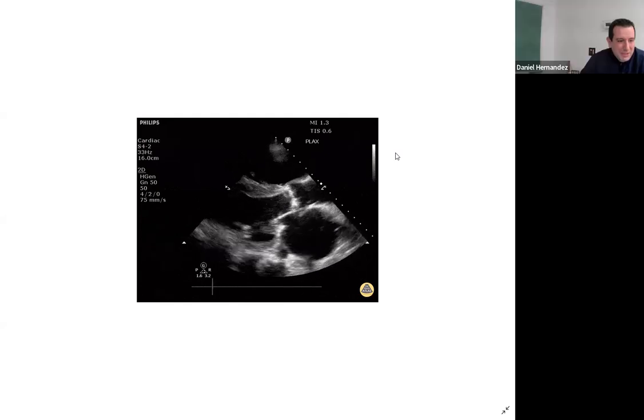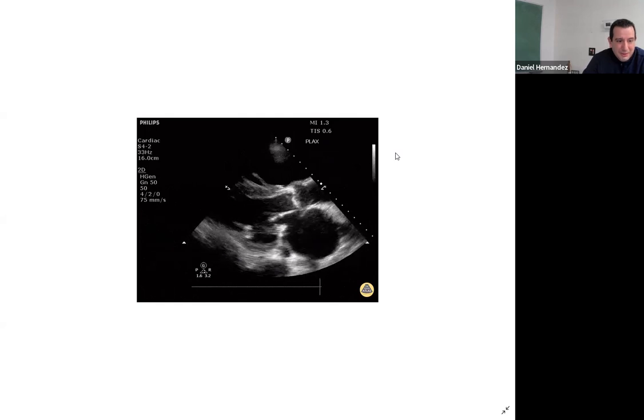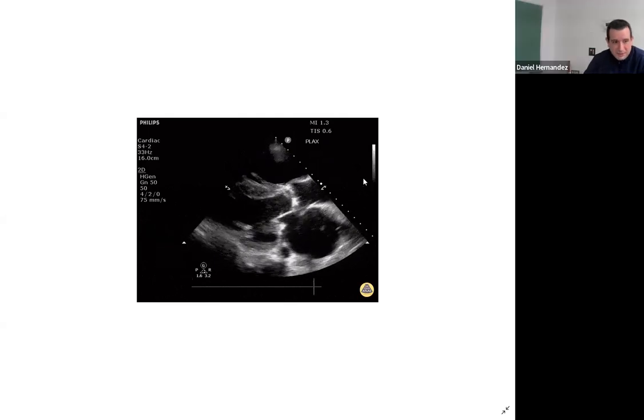Yeah, I mean, we pretty much nailed almost everything. I would also be worried about the potential for left ventricular thrombus because this EF looks terrible. Maybe this guy's apex is completely down too. There's a potential for LV thrombus as well. What about aortic dilation because of the stenosis? Yeah, the aorta looks dilated as well.